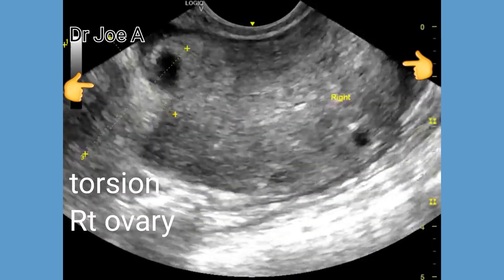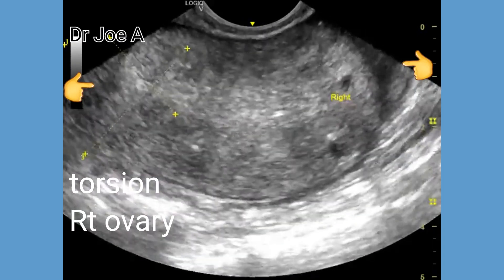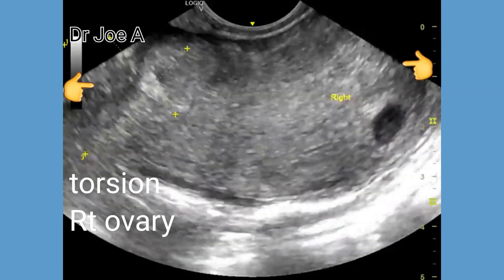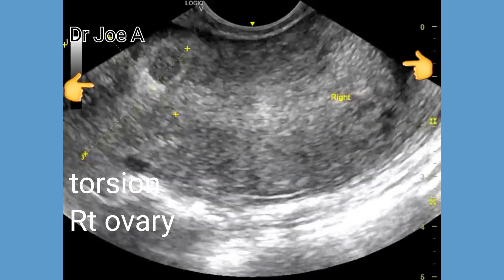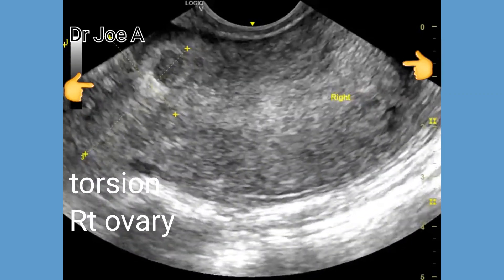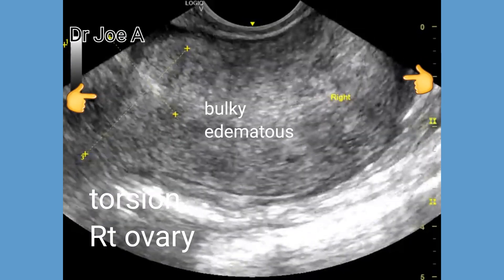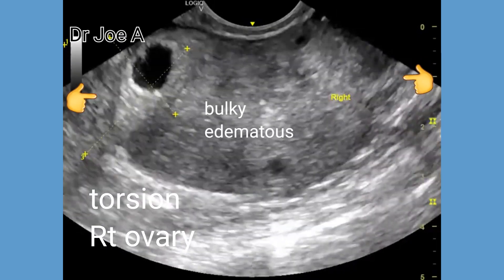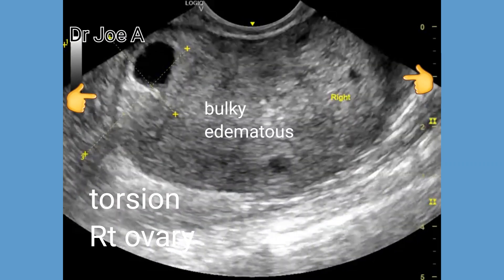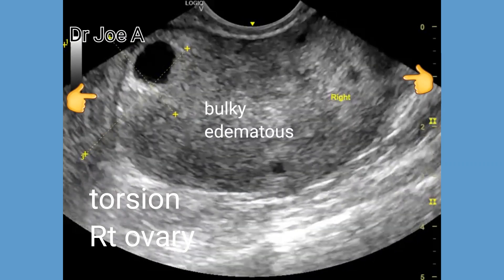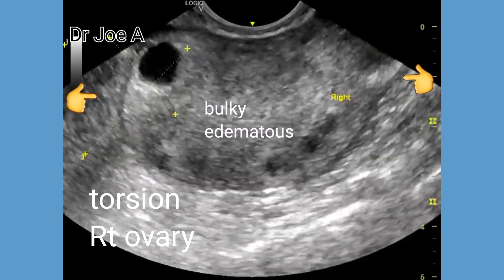The right ovary shows edematous parenchyma, seen as inhomogeneous hypoechoic ecotexture. The right ovary also shows multiple peripheral follicles, which are pushed to the periphery of the right ovary due to edema.